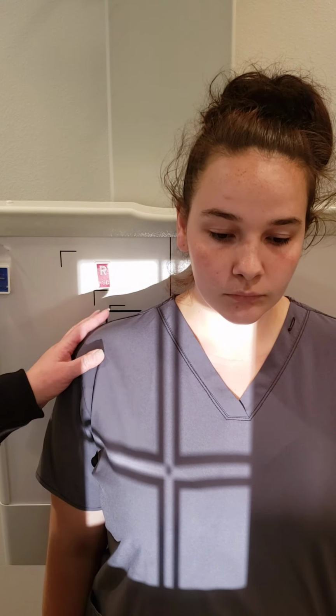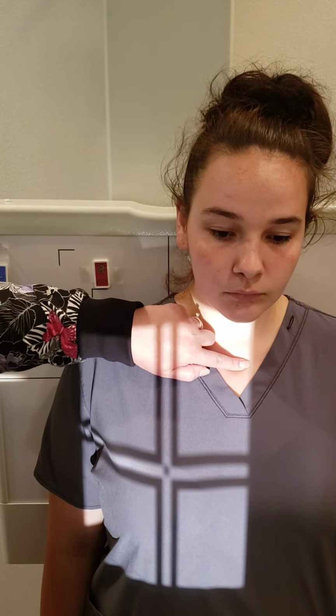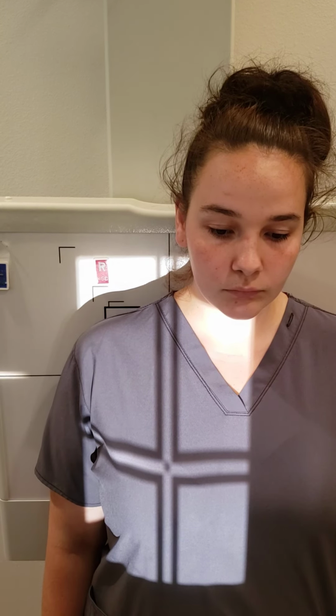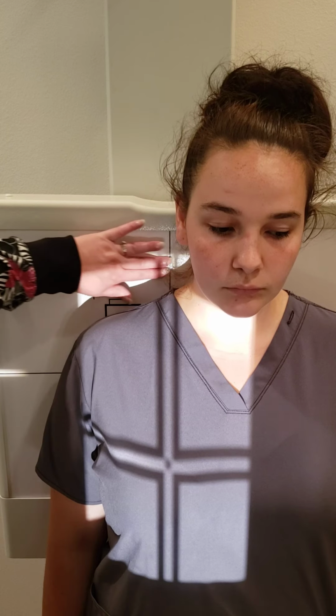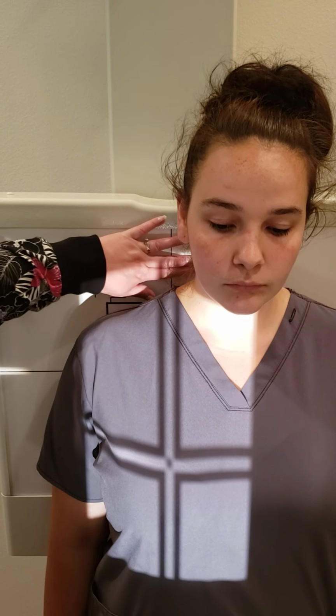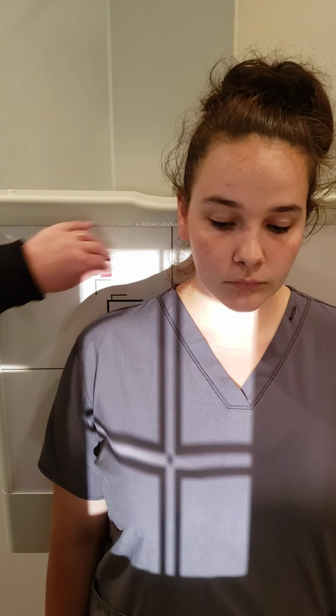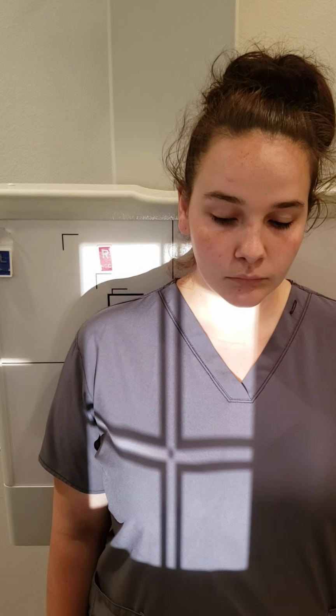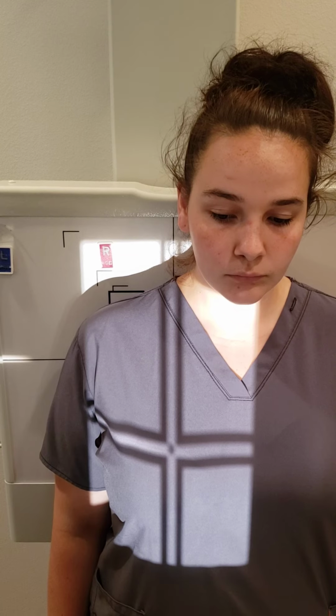There you go. We want to be centered at T7. So I'm going to find jugular notch and go down approximately 4 inches. And I do want to make sure that I can clearly see that we're going to get T1 at the superior portion. I've got my marker here in the upper section out of the anatomy.